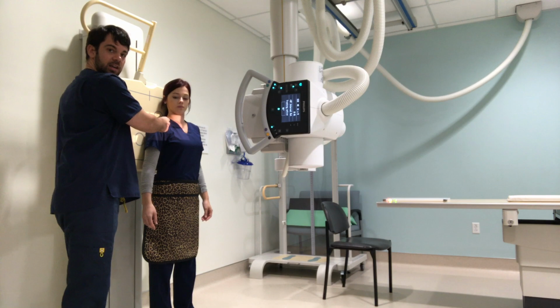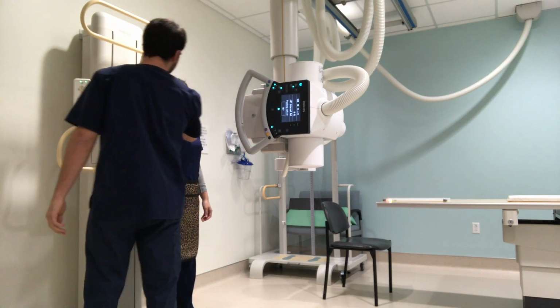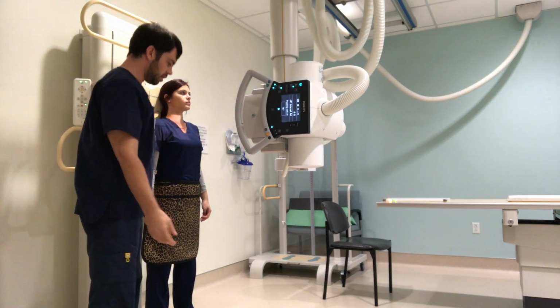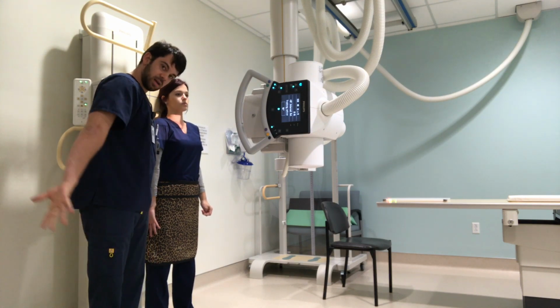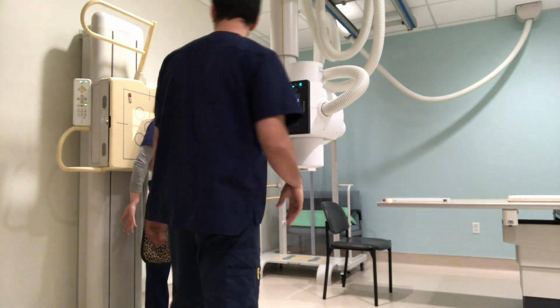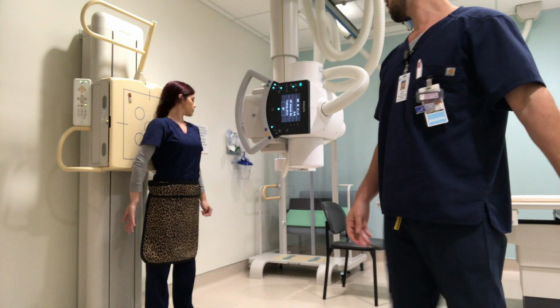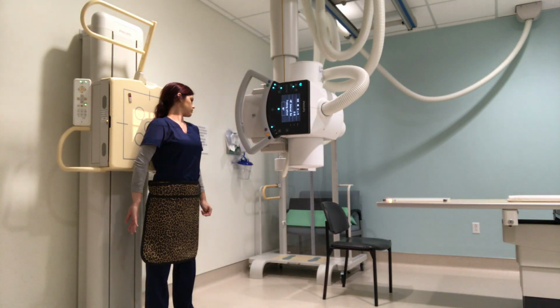I'm centered right here, about an inch below the coracoid. My field light is over here. I've got the SC joint, and I have the shoulder. Now, can you do me a favor and rotate the back side of your hand and touch your hip? Now let it out a little bit. Perfect. That's going to give us a great view of the lesser tubercle. Now if you could turn your head away from your shoulder, I just like to keep the head, the neck and the chin completely out of there if possible. All right, X-ray. Okay, that's the first one.